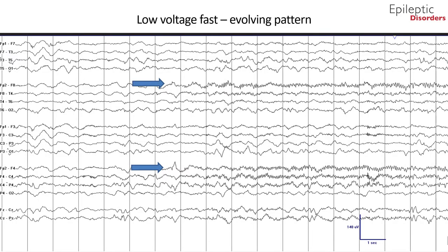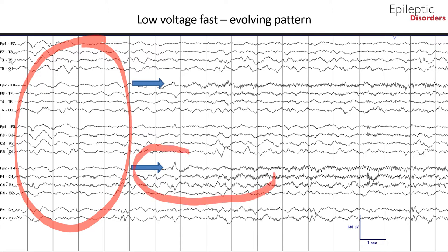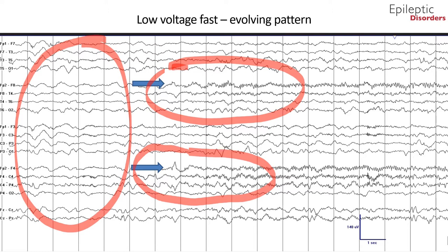The next seizure is a right frontal focal seizure with initial onset as low-voltage fast activity and an evolving pattern. In this bipolar montage EEG, shown in the first 4 to 5 seconds of the page is the background rhythm, comprising mainly of 1 to 2 Hz generalized delta activity. The blue arrows depict the onset of the seizure as an initial sharply contoured waveform followed by low-voltage, less than 10 µV, fast frequency activity between 13 to 17 Hz.